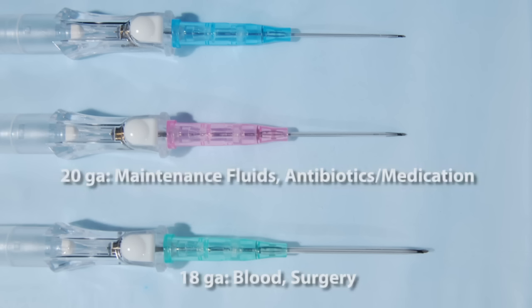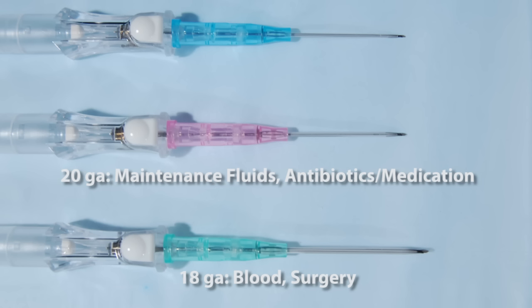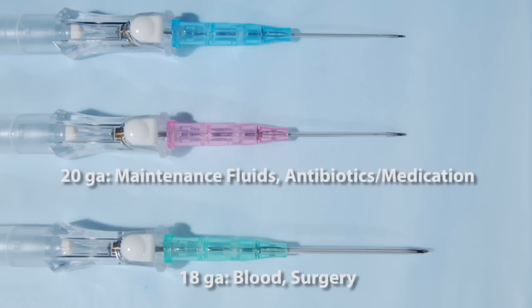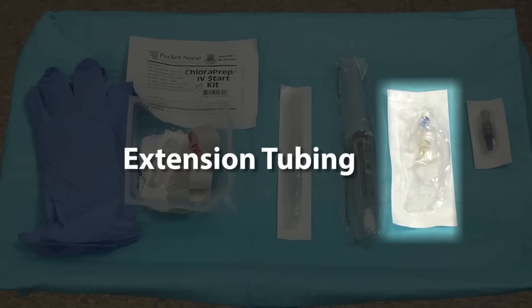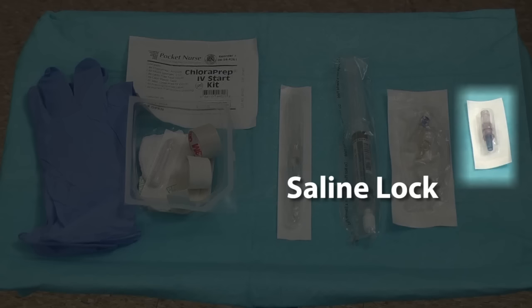Most often, a 20-gauge angiocath is chosen if the patient is receiving maintenance fluids or antibiotics and medication. If the patient is going to receive blood or go to surgery, an 18-gauge angiocath is required. Saline flush 3 to 10 milliliters, extension tubing, and saline lock.